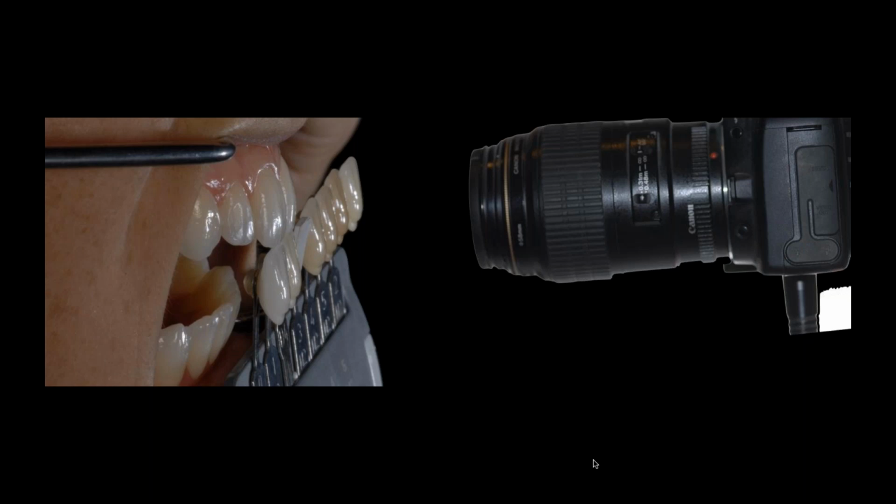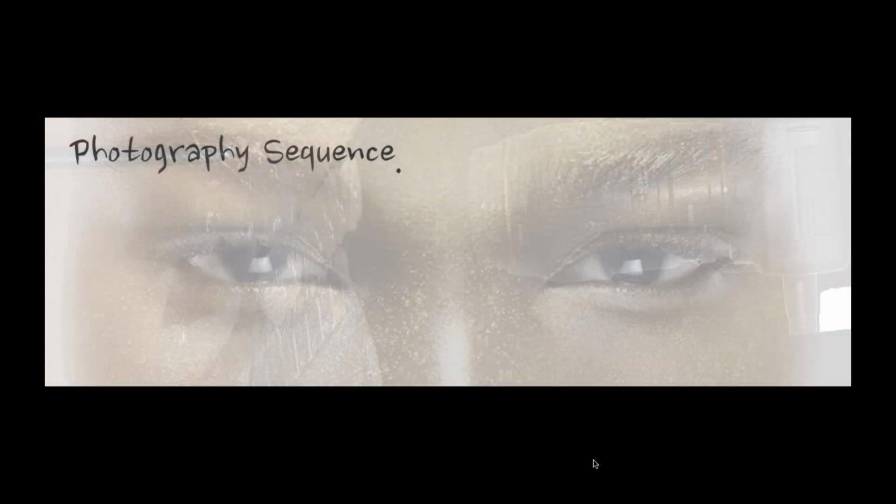I don't want shade tabs in edentulous areas. I don't want them on top of the teeth. I don't want them over the teeth. Those things really don't allow us to see the proper shading because the eye doesn't see color in depth as well as it sees it on a flatter plane. So it's really important that we keep those shade tabs in the right position.